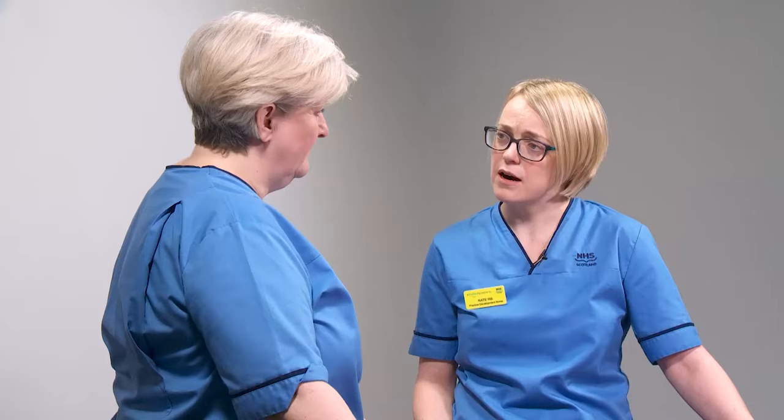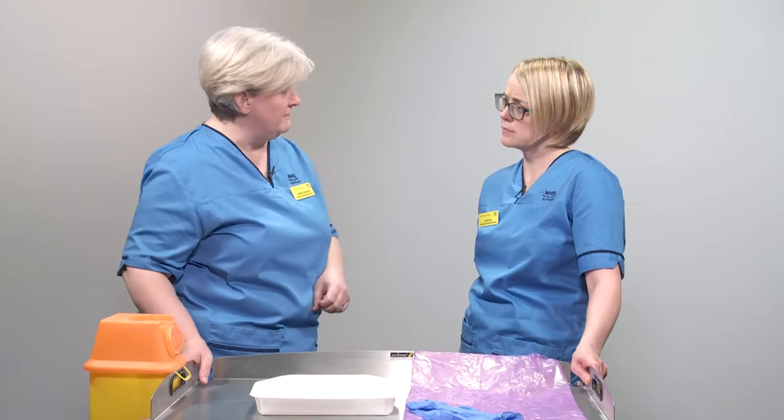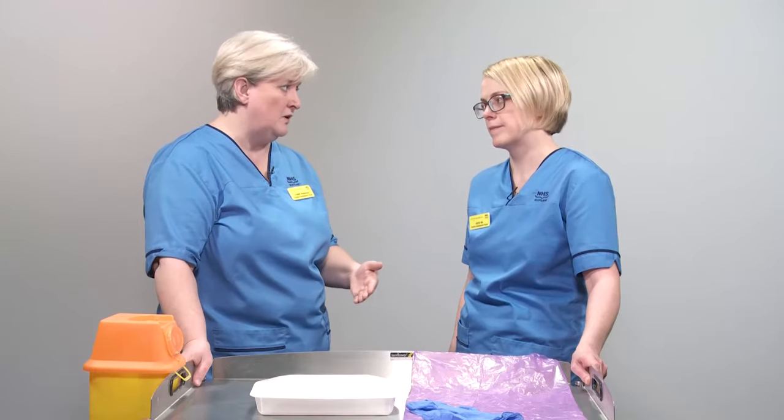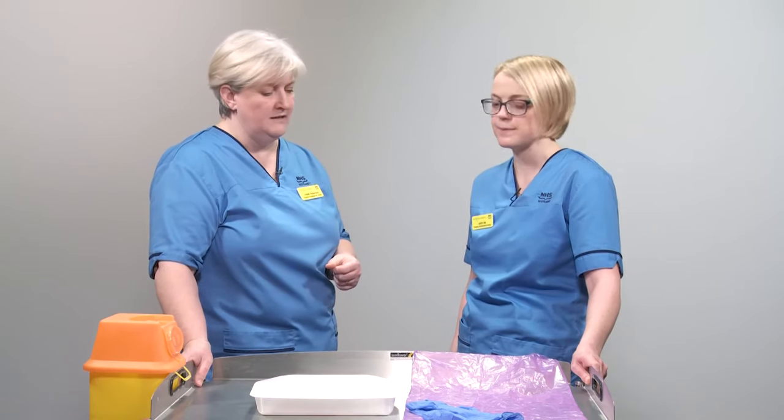Now we're ready to prepare our IV medicine. The first thing we need to do is wash and decontaminate our hands, then put our PPE on and gather all our equipment together on our tray with our sharps bin. PPE for this is our purple aprons and nitrile gloves. The purple apron signifies that we're dealing with medicines — it's meant to remind everybody not to interrupt us, because if we're interrupted during an important calculation it can break our train of thought and that's when errors are more likely to happen.